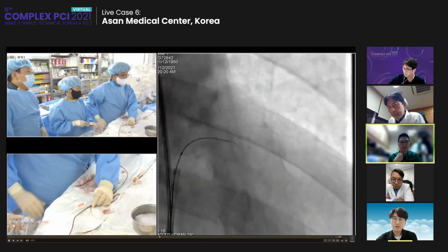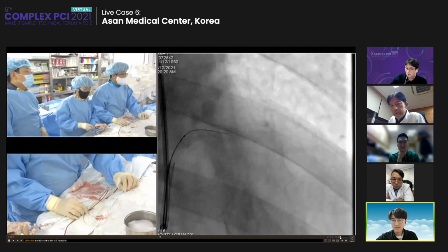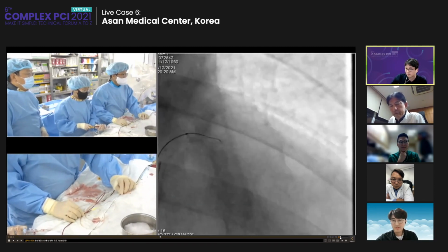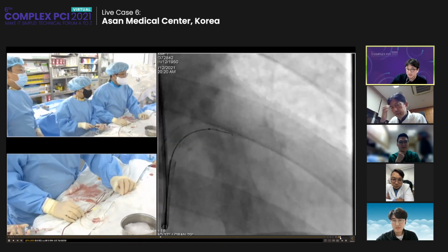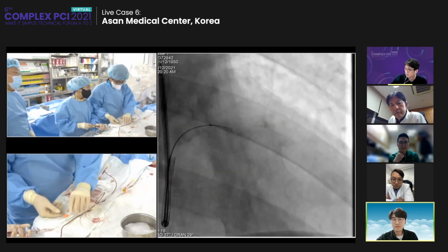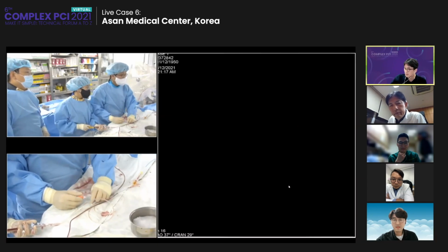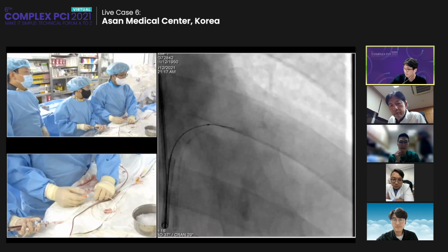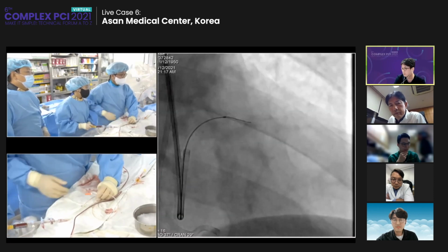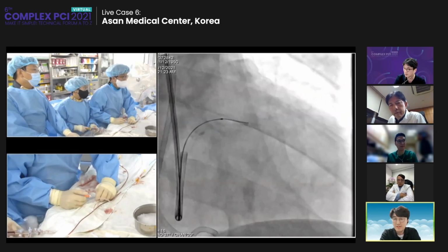Dr. Pyramid, how about your feel during the wire advance? Fine Cross a little bit more, actually. I had some resistance at some point, and I will tell you where the resistance was. I think it was at this point. And then I don't want to just drill it, but I want the exact site of the CT calcified segment.